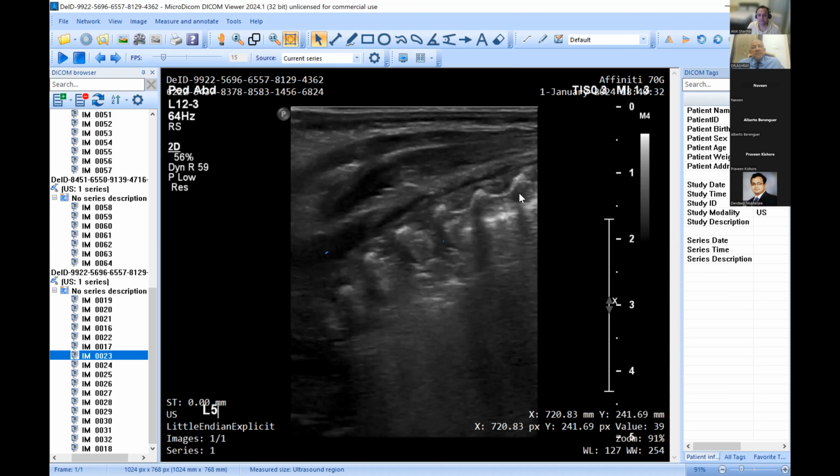I'm having a look and I'm trying to think. We can't have two pathologies at the same time, can we? Atelectasis, and there is this zone in the middle where the pleura is not continuous. I don't want to say fractal or shred sign, but it just looks a bit irregular in the middle. So let's start with the protocol. Can you see a batwing sign? At some places I think I can, but not throughout.